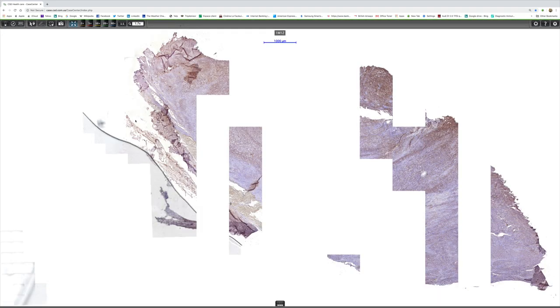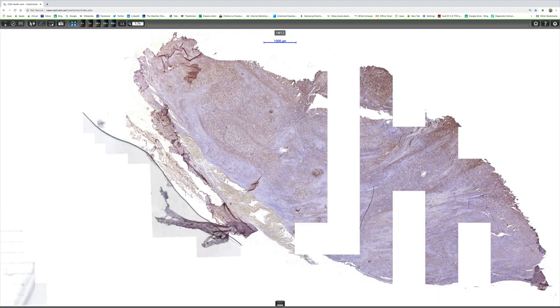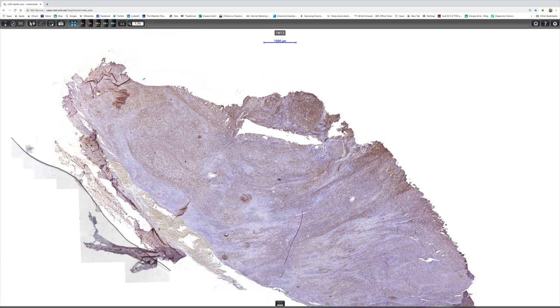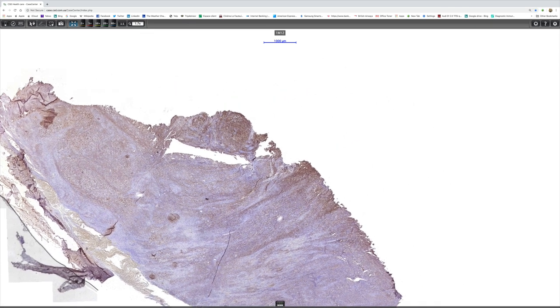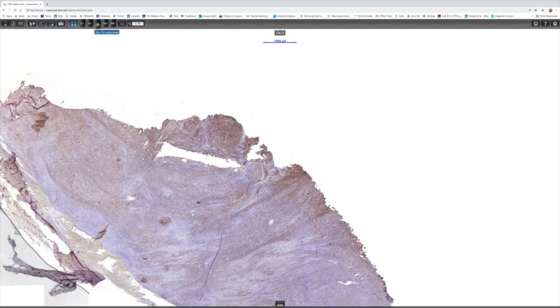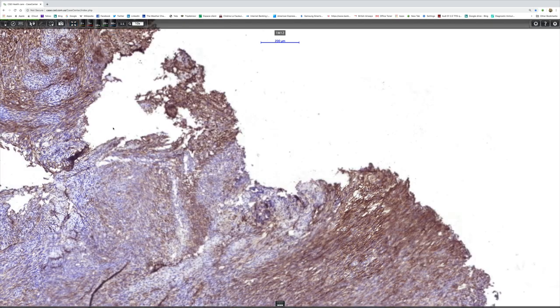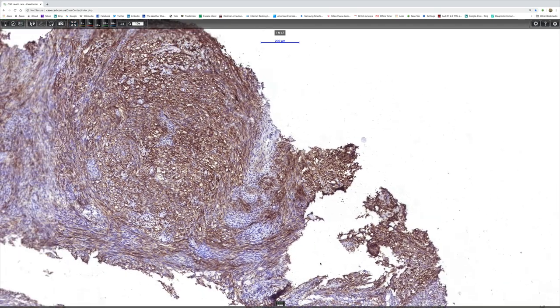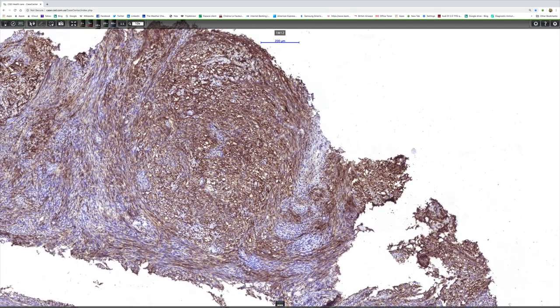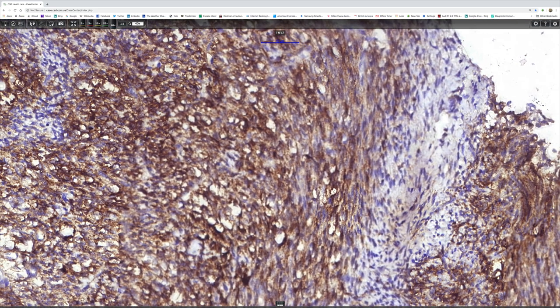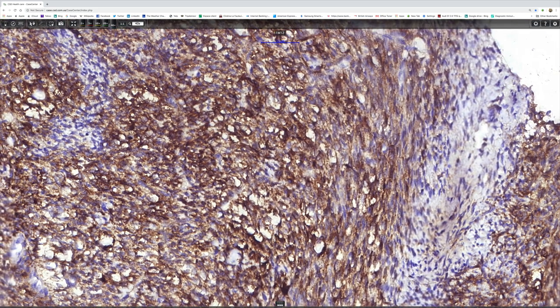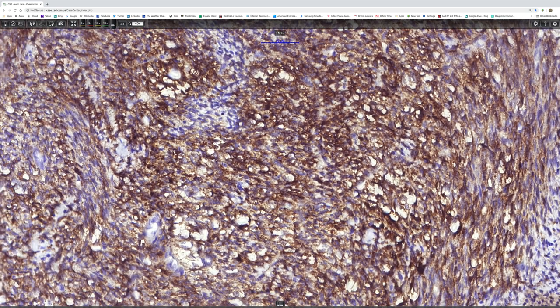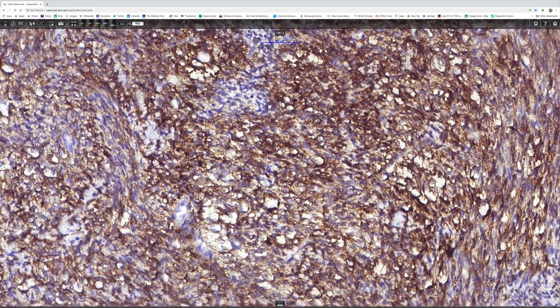It's very strikingly positive. We'll look at this top bit because, although it's near the edge, it's really very striking. It's a gorgeous field there if you wanted positivity with EMA in a synovial sarcoma. I don't think you could get better than that.